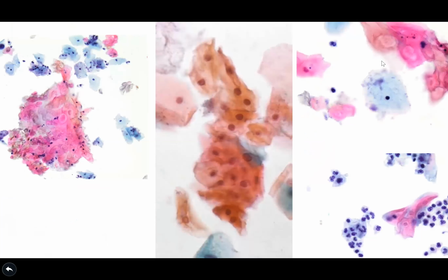Excuse me, this is totally acting up today. So over here, we can look at this one where you can see how it's starting to get more and more keratinized, I guess. What else can we talk about here?